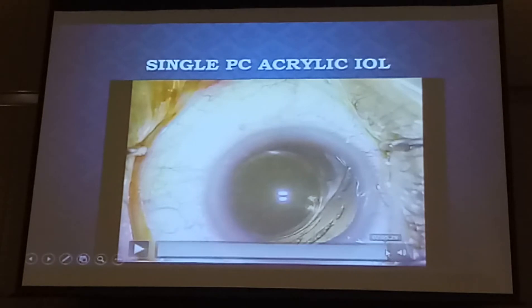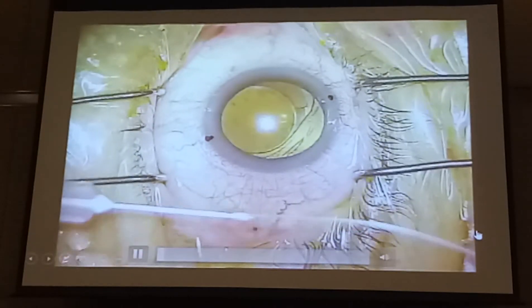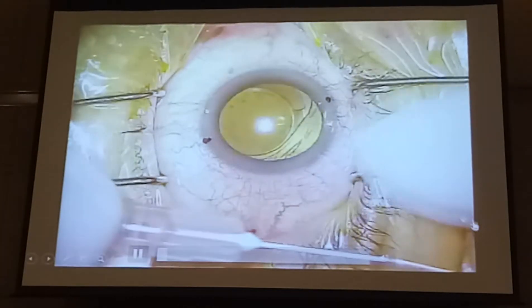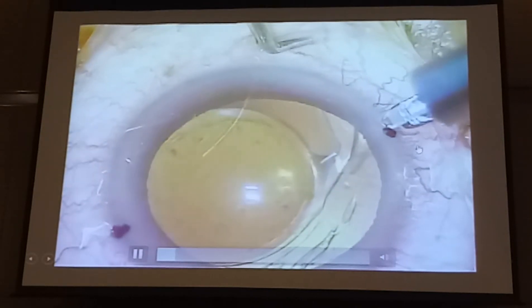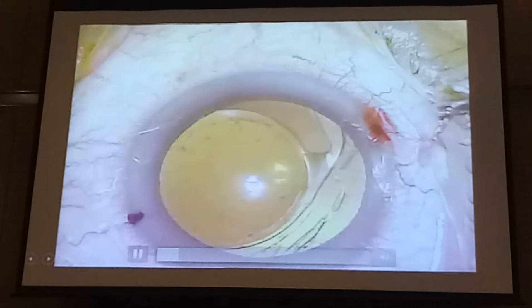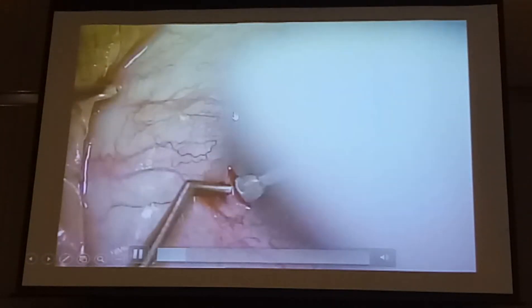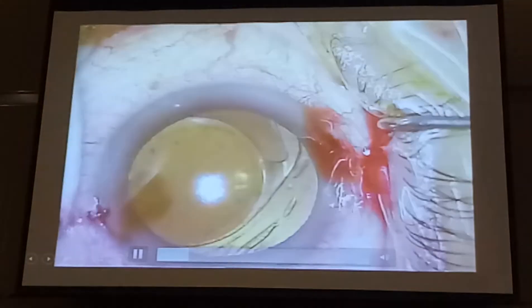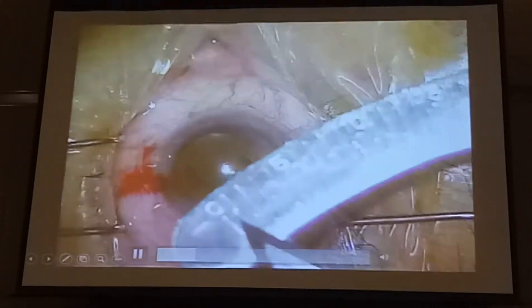If not, you can thread more haptic or less haptic in to centre the IOL. I find this is the most reproducible, and it takes about 30 to 40 minutes to complete, but at least I know that I always have a perfectly centred lens. We now just quickly talk about scleral suturing.